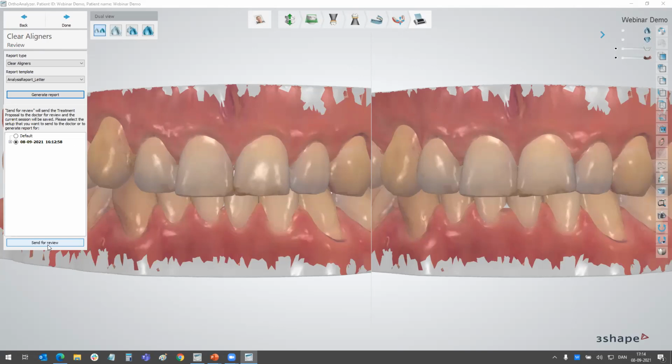Then there's a question here: when will we have a 2D cross section in 3D web preview? Thank you for that suggestion. I cannot give you a date now, but we will make sure to include that on the list of features that we are considering for future enhancements. I'm assuming you mean on the Treatment Review platform, but we will make sure to add it there to the list of requests.